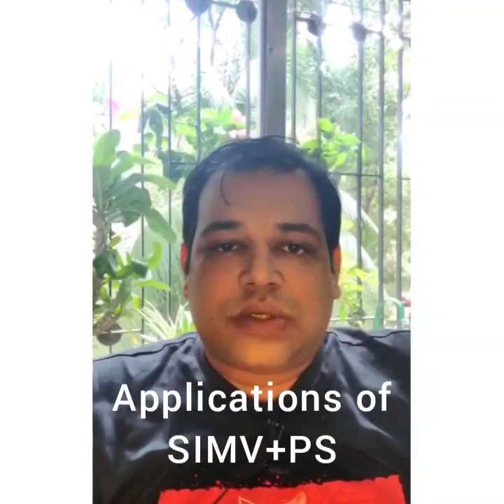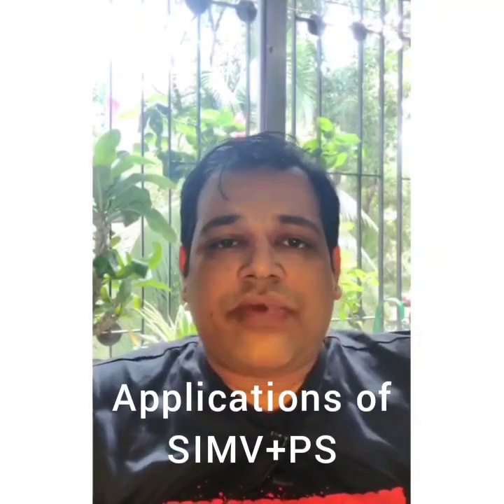But putting the patient on SIMV may rather increase the work of breathing and may rather prolong the weaning process. So now when will you use SIMV? In our practice, we don't routinely use SIMV alone. We use it as SIMV plus pressure support. So whatever the patient's own breaths are would be supported with a pressure support, and whatever mandatory breaths are will be supported with your set tidal volume or your set pressure.